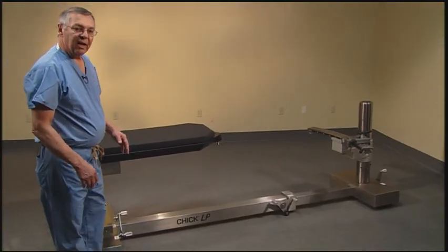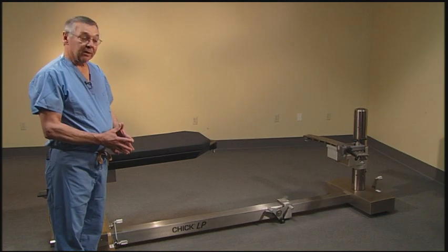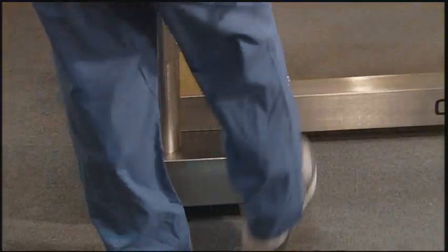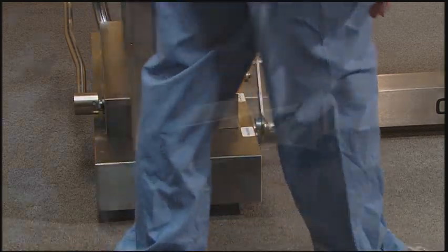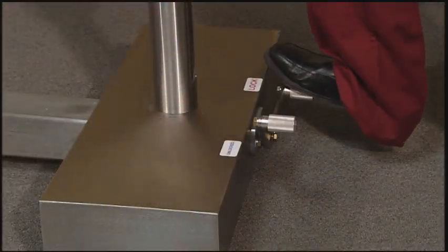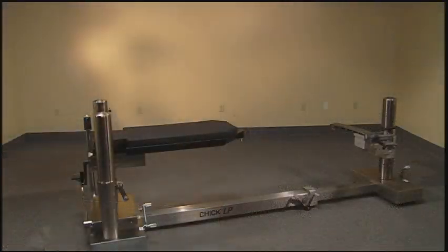We recommend that two staff members move the surgical table into the operating suite and position it correctly under the lights. We'll lock the head end, then the center lock and the foot end lock. Now the table is secured to the floor.